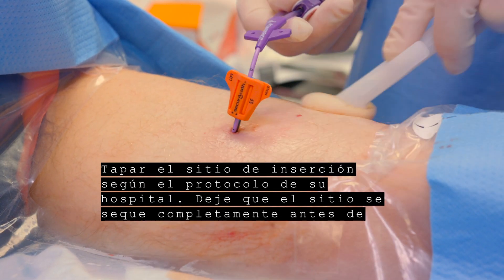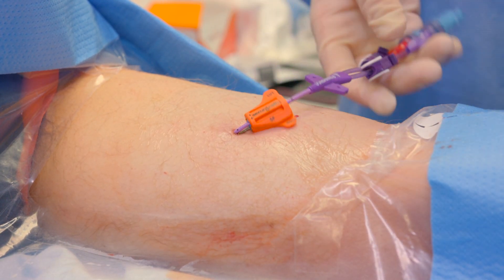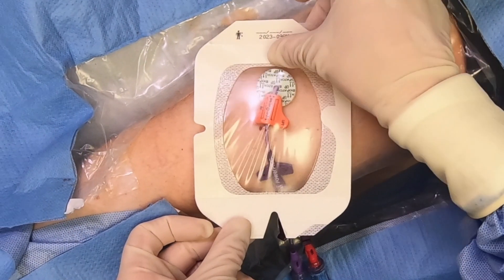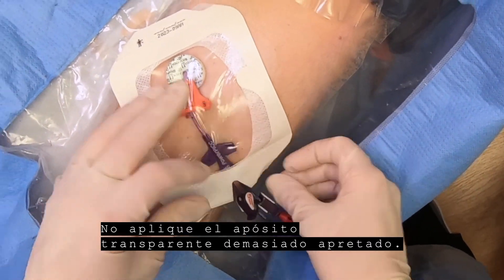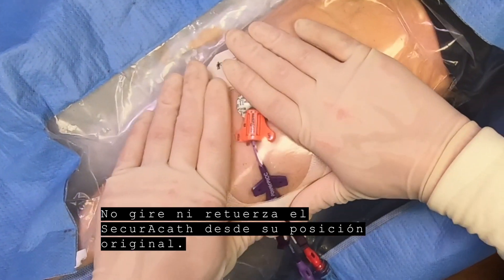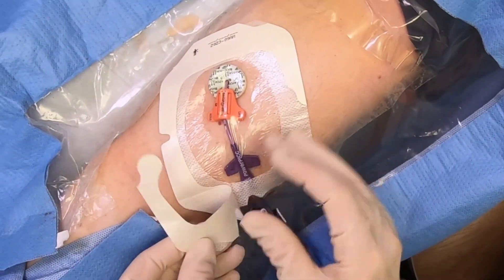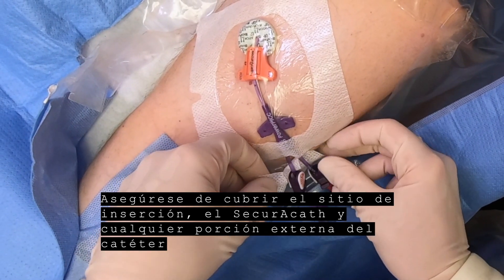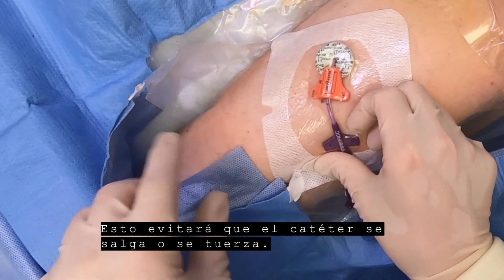Dress the catheter site per your institute's protocol. Let the site dry completely before applying any dressing. The SecuraCath works with all dressings and antimicrobial discs. Do not apply the transparent dressing too tightly. Do not turn or twist the SecuraCath from its original position. Be sure to cover the insertion site, the SecuraCath, and any external portion of the catheter up to the extension tubes with the transparent dressing. This will prevent pulling or kinking of the catheter.